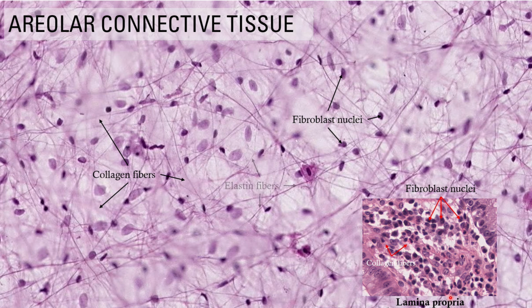Smaller, thinner elastin fibers run around the collagen network. Note how you cannot see the elastin well in the lamina propria. In between these protein fibers and resident cells, the copious amounts of white space are filled with ground substance. Usually, the ground substance does not take most dyes or stains, so it appears clear.